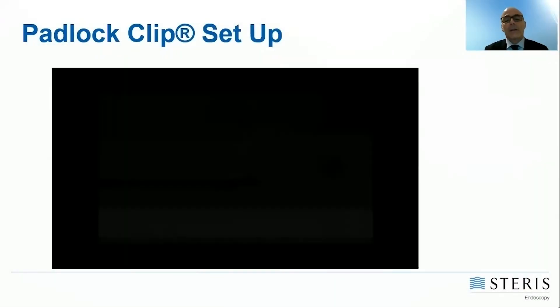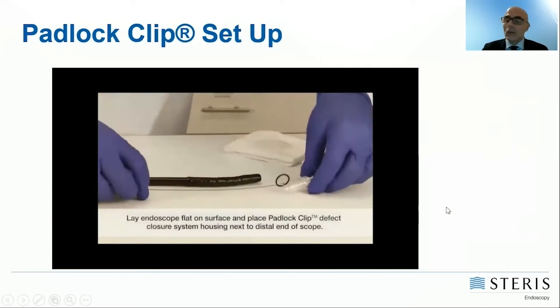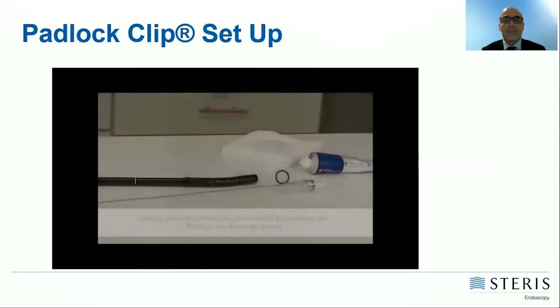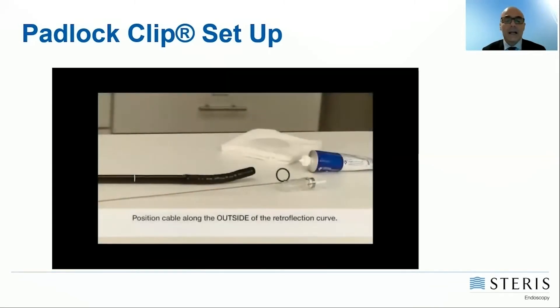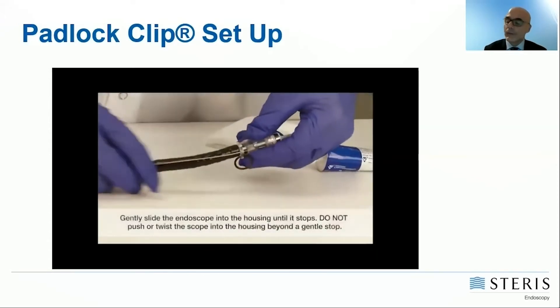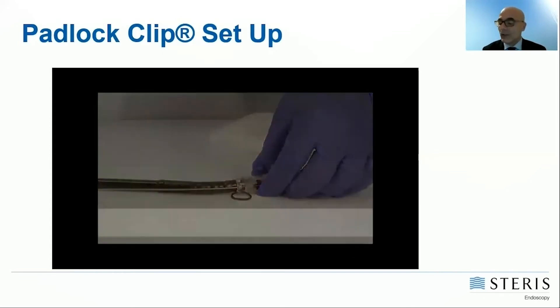The video reports how to apply the clip on the tip of the endoscope. The endoscope should lie on a surface and the full retroflexion should be identified. Then the linking cable should be positioned along the retroflexion curve and the cap is mounted on the tip of the scope.